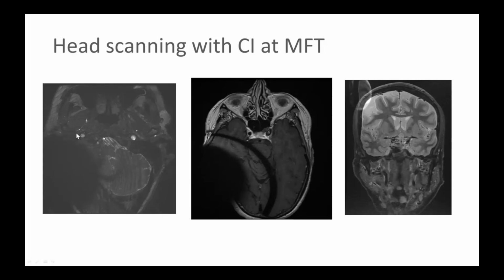But also, because of the nature of the pulse sequence, there are many banded fringes that radiate away from the implant that can potentially hinder diagnostic ability for these sequences. The second panel shows a turbo spin echo sequence with FATSAT applied. See the extent of the original void from the implant, but then there's a second band of signal void potentially related to the FATSAT pulse.